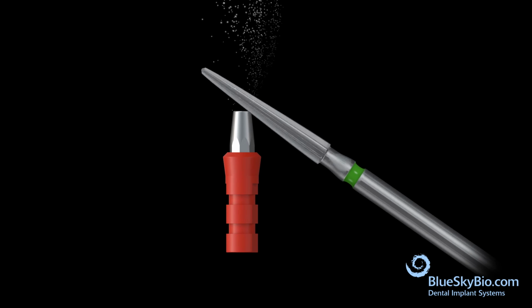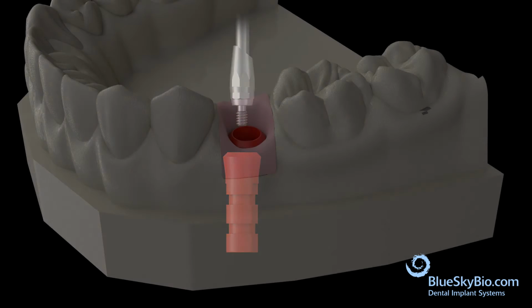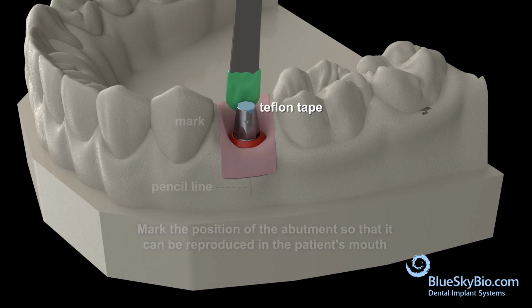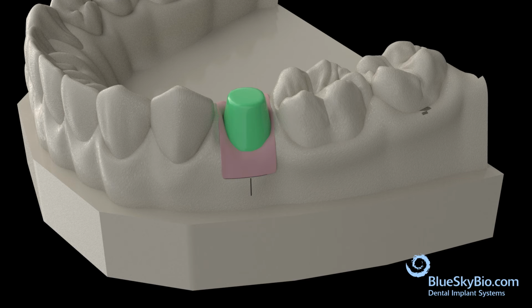Use a burr to shape the abutment to the desired shape. Reinsert the abutment into the stone model. Mark the position of the abutment so that it can be reproduced in the patient's mouth. Block out screw access hole with Teflon tape. Wax up and cast the under casting in the usual manner. Apply the ceramic in the usual manner and complete the restoration.